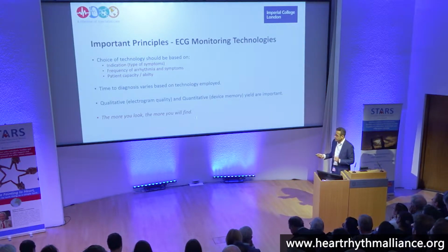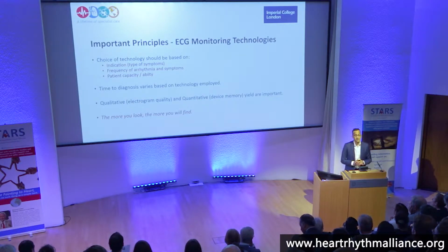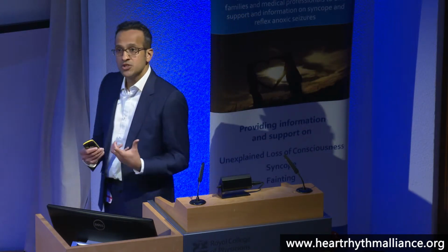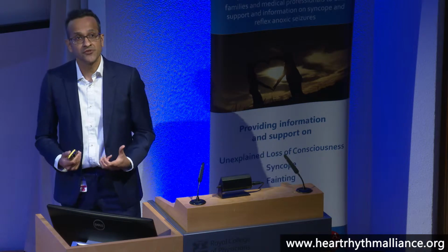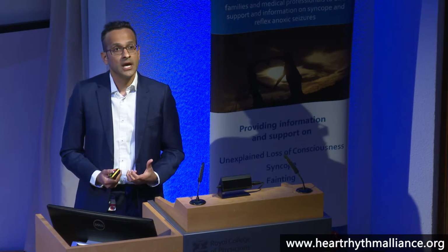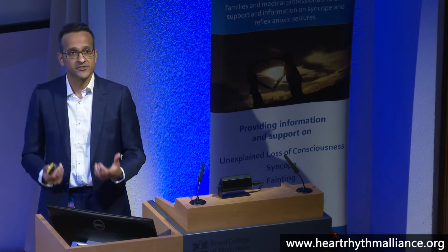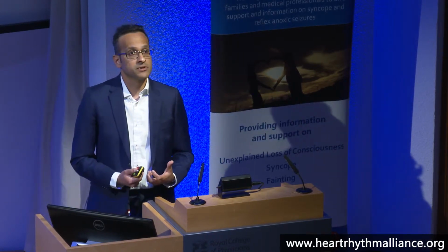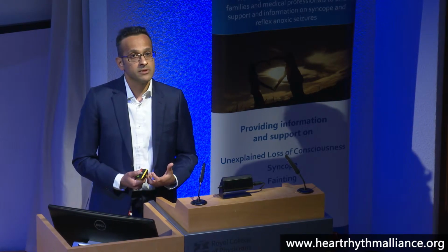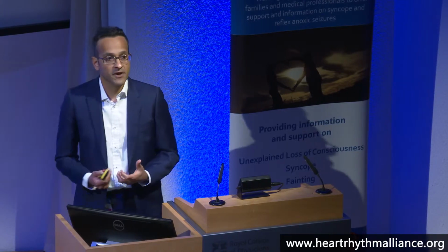The prevailing principle here is the more you look, the more you will find, okay? If you don't want to find anything, don't look, okay? If you have made your diagnosis of vasovagal syncope in the clinic in a 17-year-old schoolgirl, okay, are you going to pace this patient? And are you going to act on 6-7 second pauses, which are infrequent? Okay? So why bother monitoring that patient, other than to define the mechanism?